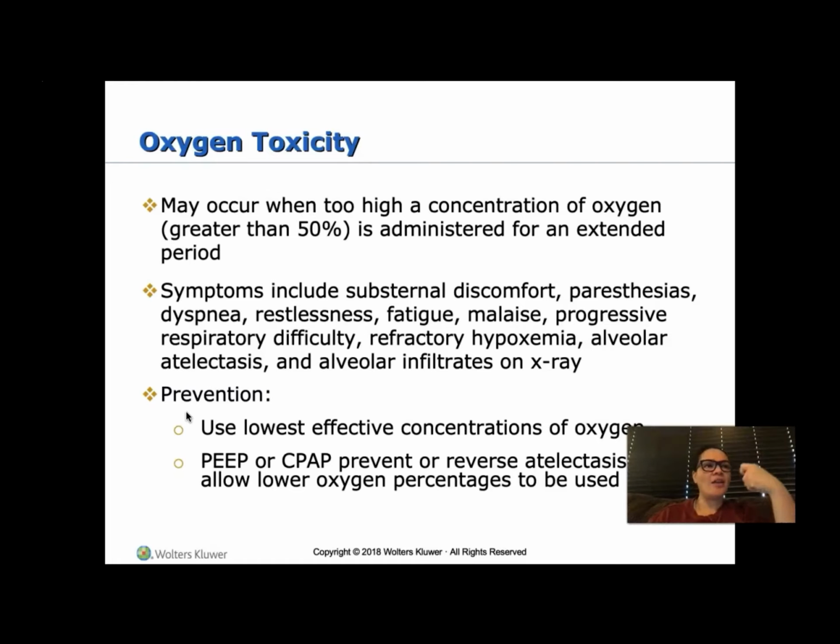Get the cannula on. Get the cannula on. Do they really need it? What are their oxygen levels telling us? Okay, this is huge, especially with COPD, because they can't excrete that CO2. So let's take it off.